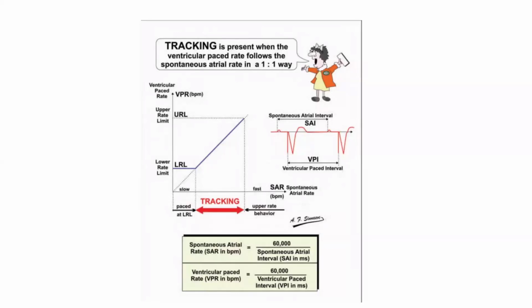This time determines the maximum rate the heart can go after. If I have, for example, an AV delay of 200 and PVARP of 300, then I have a total atrial refractory period of 500. 500 is translated to say 120 beats per minute, 120 beats per minute. And the lower rate is 60. Anything from 60 to 120, the patient is going after his sinus rate.